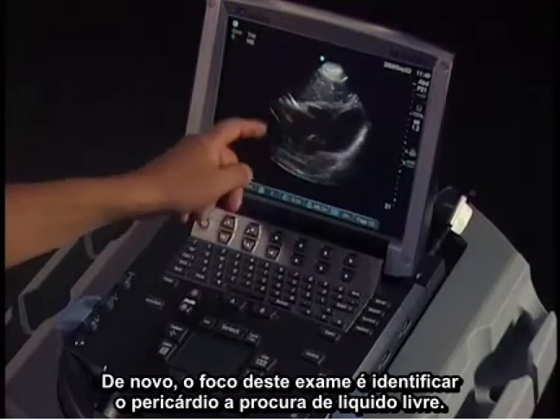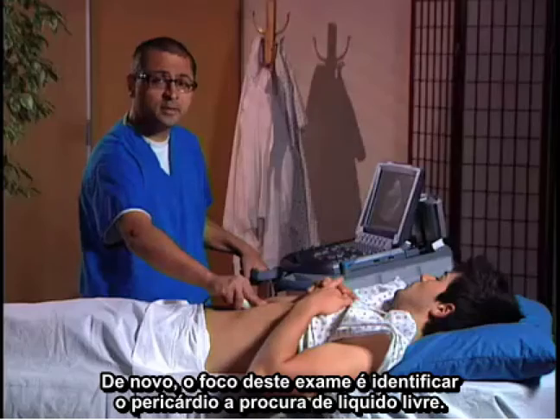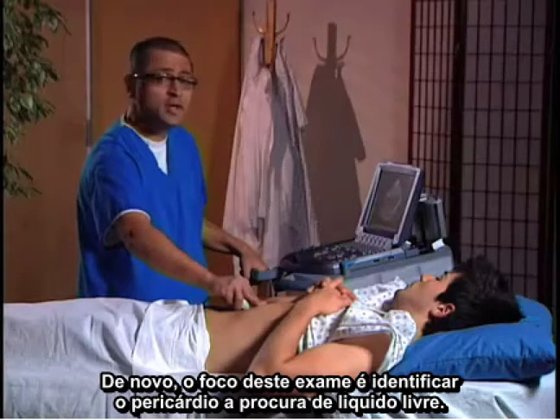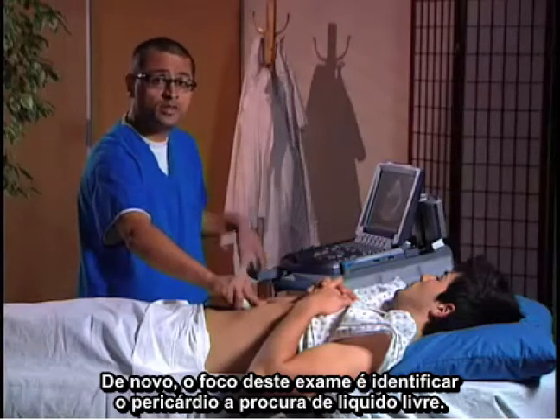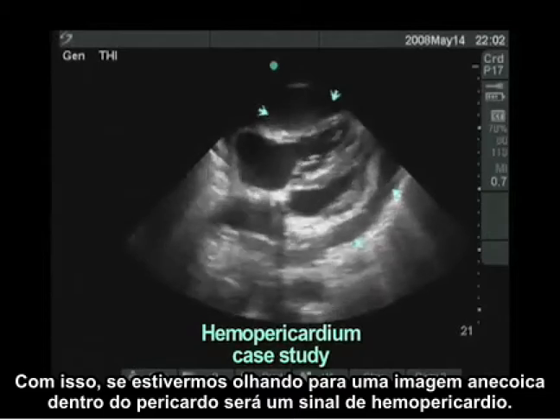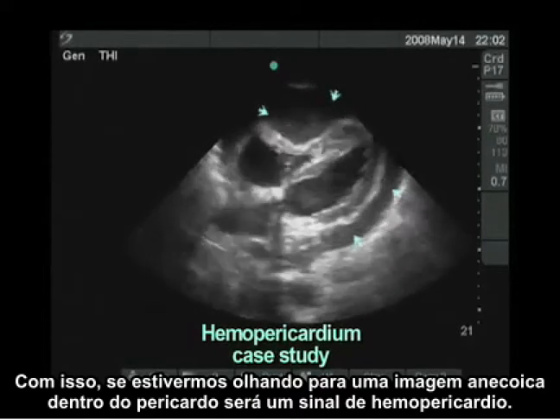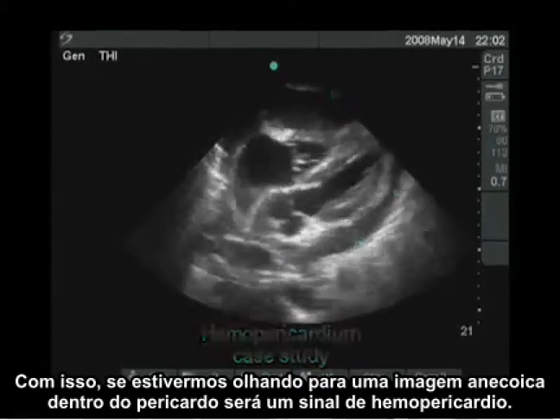Our focus on this exam is to identify the pericardium and to look for free fluid within it. What we're going to look for is an anechoic area within that pericardium, which would be signs of a hemopericardium.